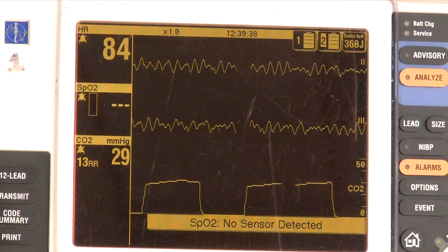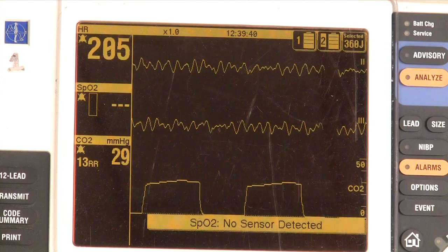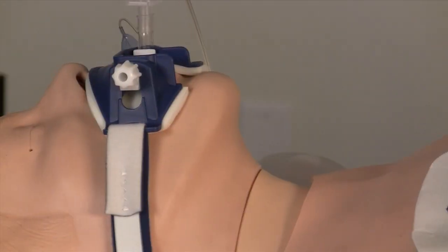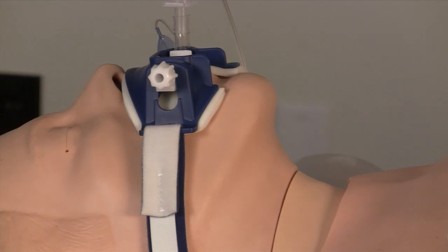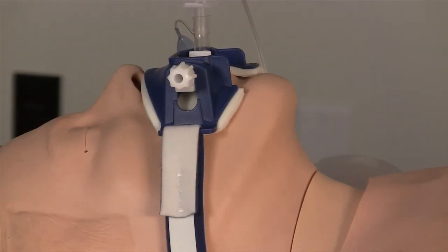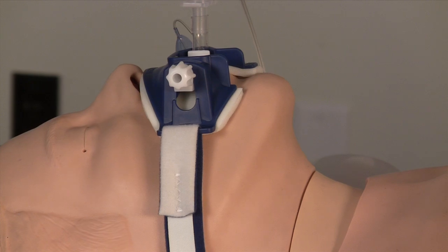Capnography sensors can be placed on endotracheal tubes, oxygen masks, or nasal cannulas. Obviously in the case of cardiac arrest, we prefer to measure CO2 off an endotracheal tube.